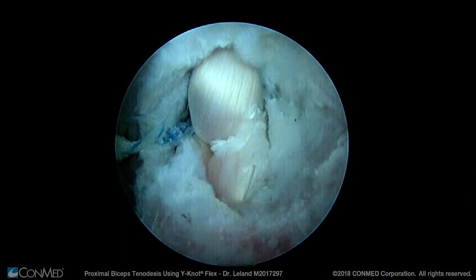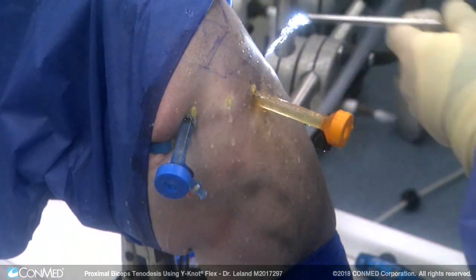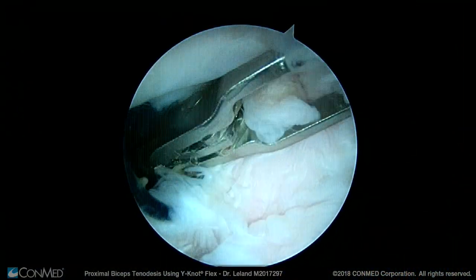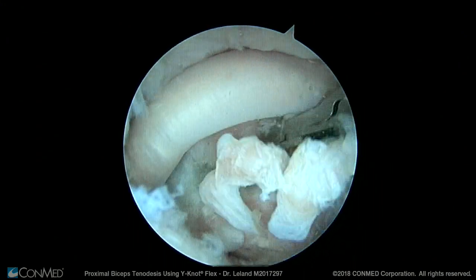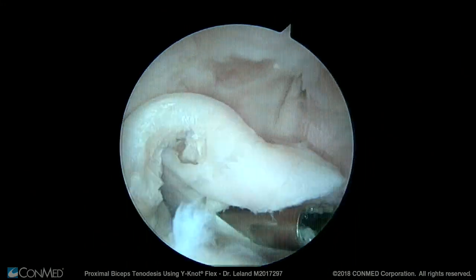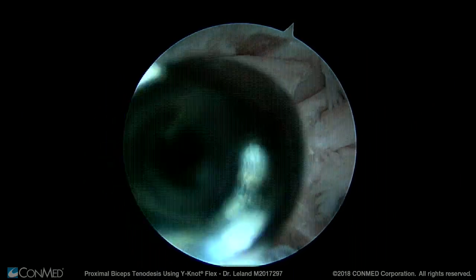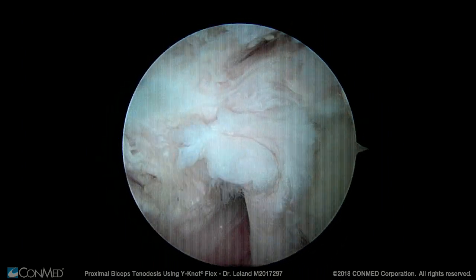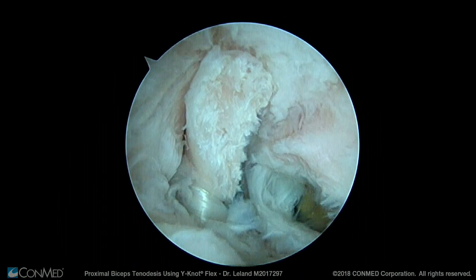Now that the tenodesis is completed with the biceps tendon at its correct working length, the scope is put back into the glenohumeral joint and we use a biter or electrocautery to cut the biceps tendon at its attachment onto the labrum, as well as where it exits through the bicipital foramen. The intraarticular portion of the biceps tendon can then be excised using a shaver. This completes the all-arthroscopic biceps tenodesis with the biceps tendon held anatomically at its normal working length.